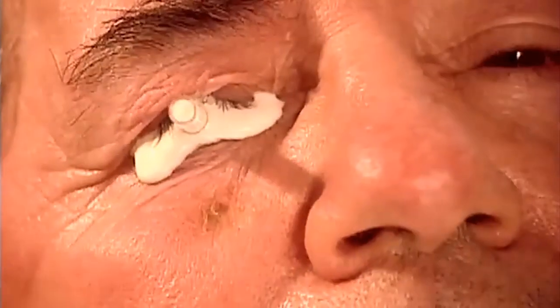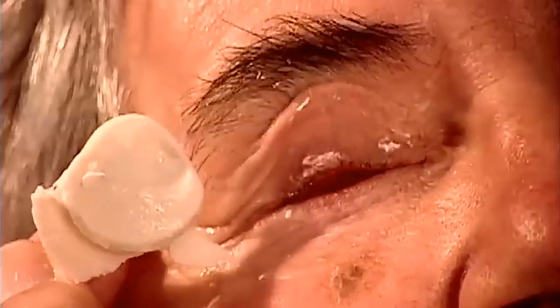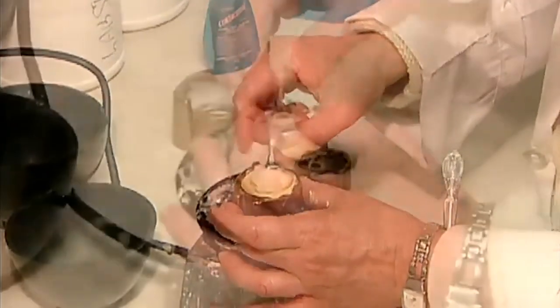No two people's eye sockets are the same, so the first step is to take an impression. After inserting the impression tray, they inject a material called alginate, filling the entire socket cavity. After 90 seconds, the alginate sets, and they can remove the hardened impression.